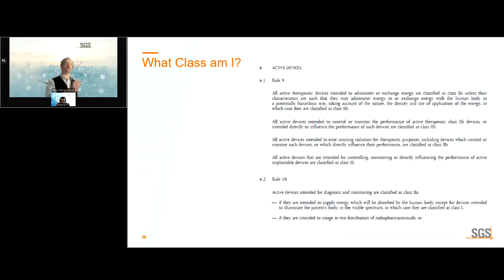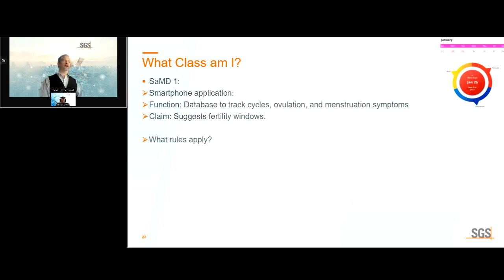So it is very easy for Rule 10 to apply to the device. And we would need to see you go through those rules and apply them in turn so that we understand how you're applying them. Of course, Rule 11 always applies, it's software. So let's start looking again at some examples.